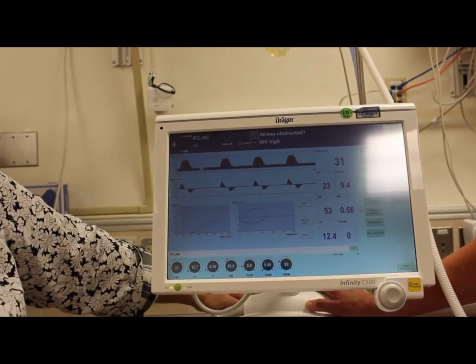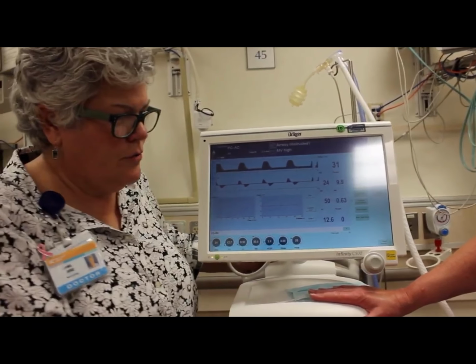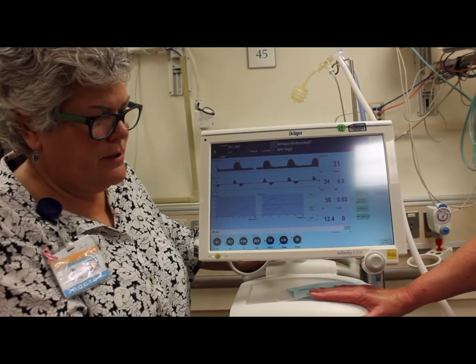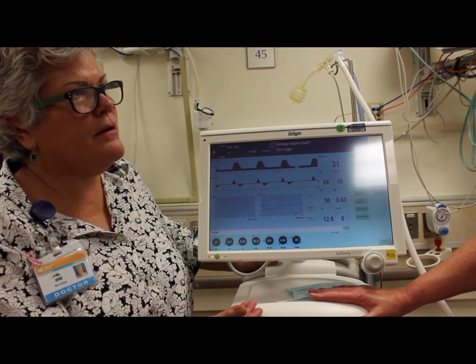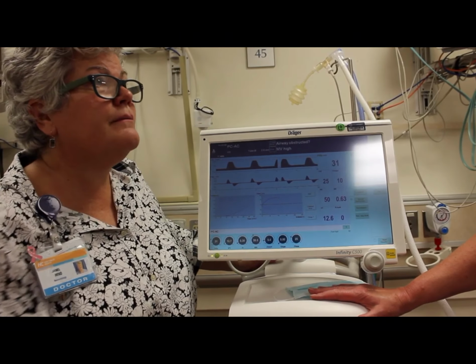Yes, definitely. We talked about rain out. So rain out is bad. It collects in the tube, it jiggles the tube, and the machine thinks that the baby's trying to take a breath. Correct. So is there any way to prevent rain out in the tube?